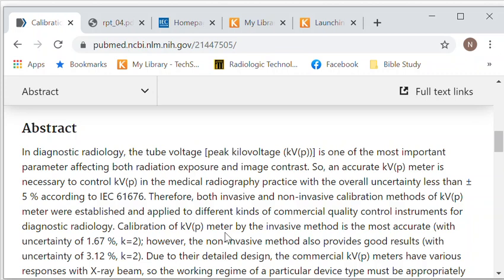Generally speaking, if you underexpose a patient by enough that it needs to be repeated, then you need to double your mAs. So carrying that forward into kVp, if we underexpose a patient by about 5%, being about a third of 15%, and 15% is what's required to double your exposure, 5% is really not all that much. It sounds like it is, but it's really not all that much.